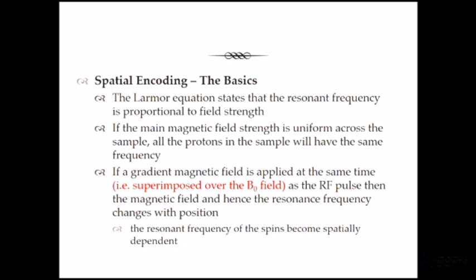On MR, all we do is manipulate how we do our slice select, and that will tell us if we're doing direct transverse, sagittal, coronal, or a combination of those to do a true oblique imaging. So let's go back to the beginning. Remember our Larmor equation: precessional frequency equals gyromagnetic ratio times magnetic field strength. That will give us the precessional frequency of protons.